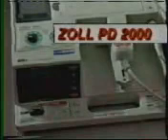As a designated basic life support provider for your unit, you are an important link in the chain of survival for a patient in cardiac arrest. This video will provide the basic overview in use of the ZOLL PD 2000 automated external defibrillator. It will cover use of the ZOLL PD 2000 AED device as it is included in the sequence of actions when responding to a cardiac arrest.